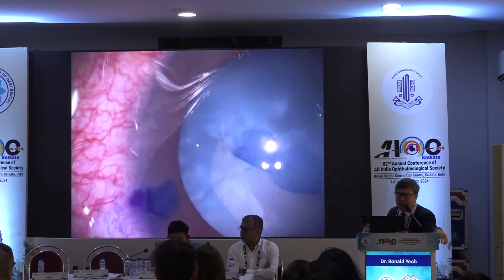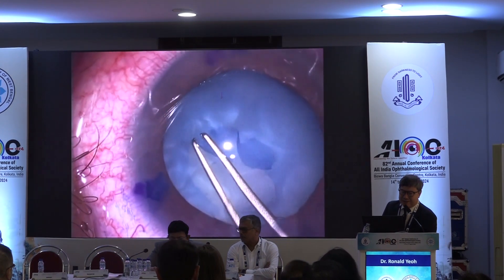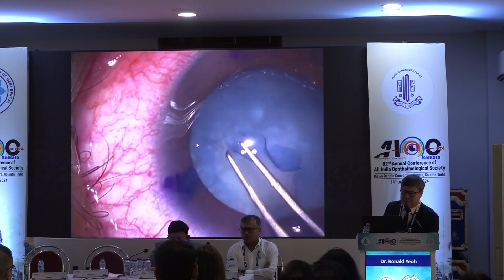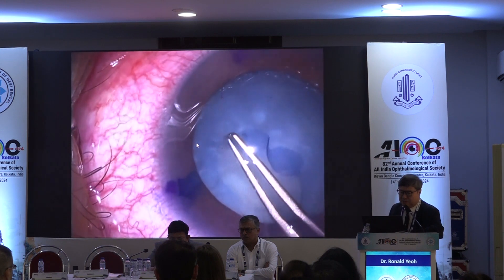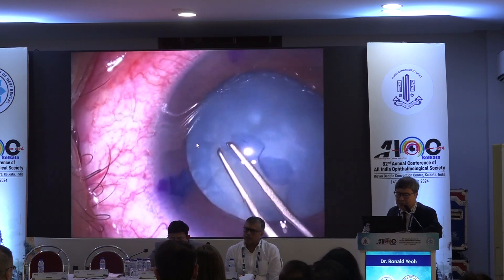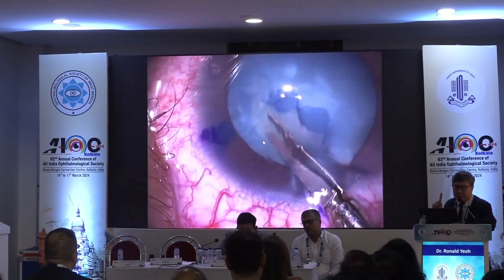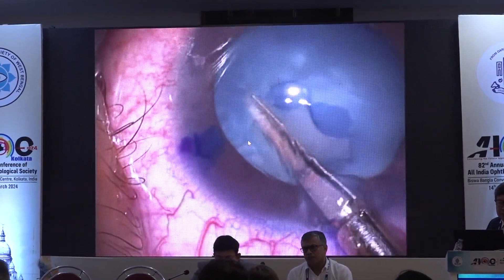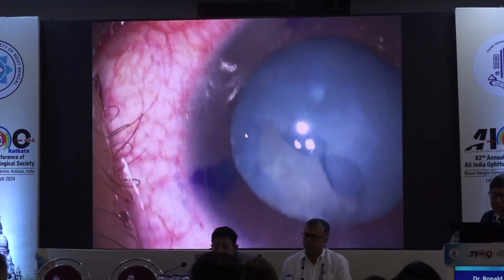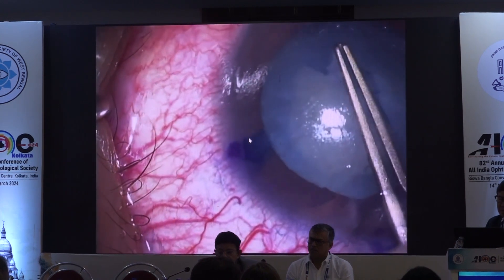I'm trying to snip it and free that band which I thought was there, and you can see that circumferential snip I've put in there. And then when I go and try to tear it, I finally realize that wasn't the offending band — it was the band that's right under my capsulorexis forceps. I'm picking at it, it's just not coming because it's still being held down by the band to the left of my forceps. Eventually I realize it and take out the Vannas scissors to do what I needed to do in the first place. You really have to pay very close attention to these white cataracts. Once that particular band was snipped off, I was able to catch that flap and continue with the rest of the rexis.